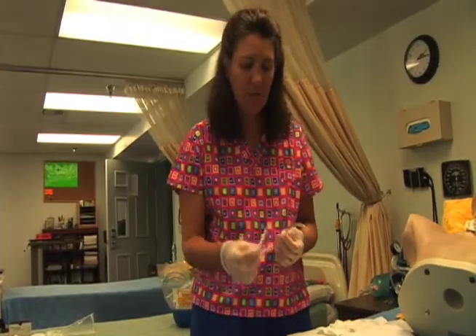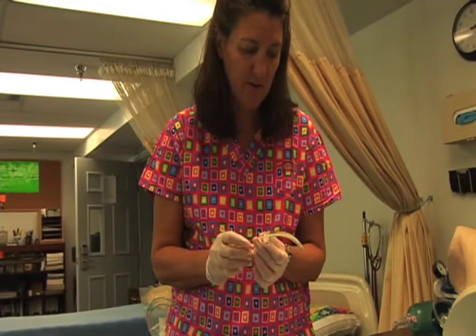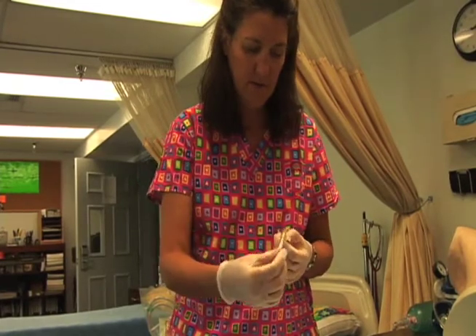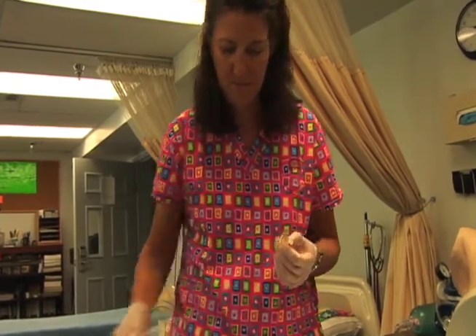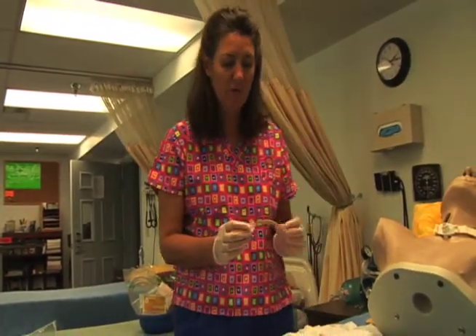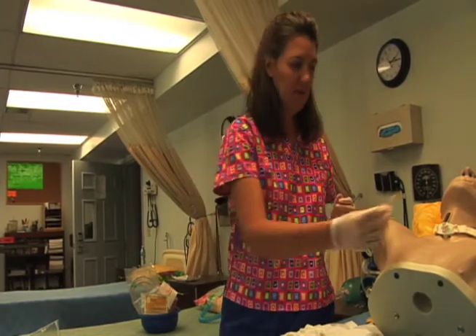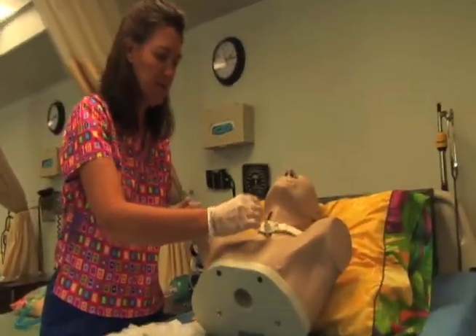And then you can take your pipe cleaner and clean out the inside of it here. Let it come through. And now it's ready and dry. If you have another 4x4, or if you haven't used both of them, you can dry the outside of it. And you're ready to put it right back in the patient.